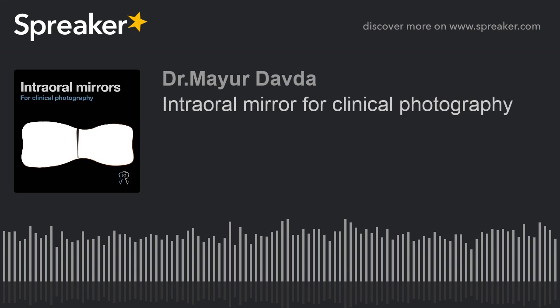This primarily happens because one reflection is actually happening from the coating surface and the other reflection is happening from the thickness of the mirror. So you will get two reflections, and it actually looks like blurring happening in place. This is why for any kind of documentation, we use front surface coated mirrors. In fact, if you're a clinician, I'm sure you understand the importance of front surface coated mouth mirrors as well.